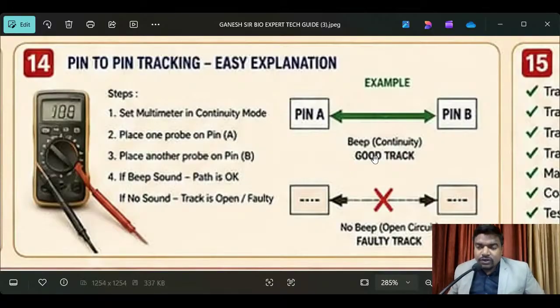You can find out, not only by seeing the components, because those are minute areas and we have to check very deeply. Sometimes, directly we can see when there is burning and damage, which is automatically visible. What is visible we can find out easily; what is not visible we have to track by using the multimeter and check it. Sometimes even if it is visible, we have to track the system and check everything by using the multimeter.